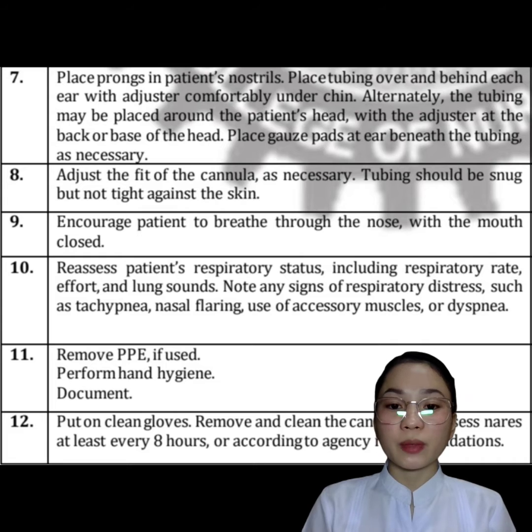Reassess patient's respiratory status, including respiratory rate, effort, and lung sounds. Note any signs of respiratory distress, such as tachypnea, nasal flaring, use of accessory muscles, or dyspnea.